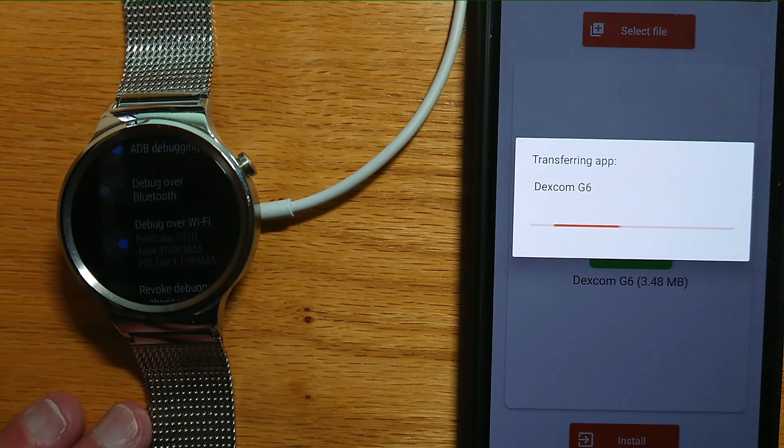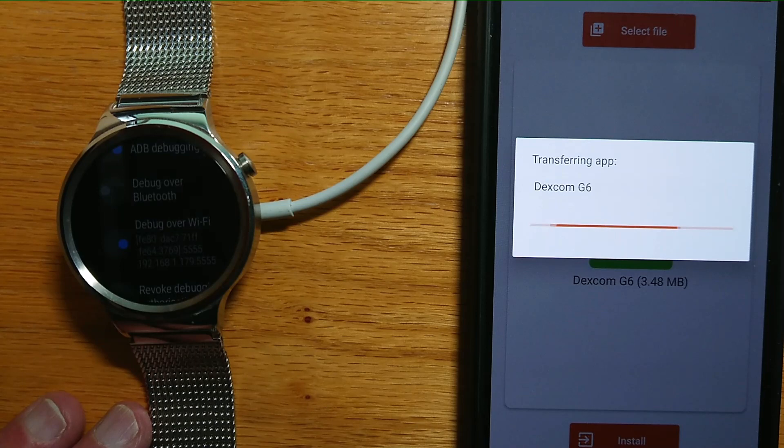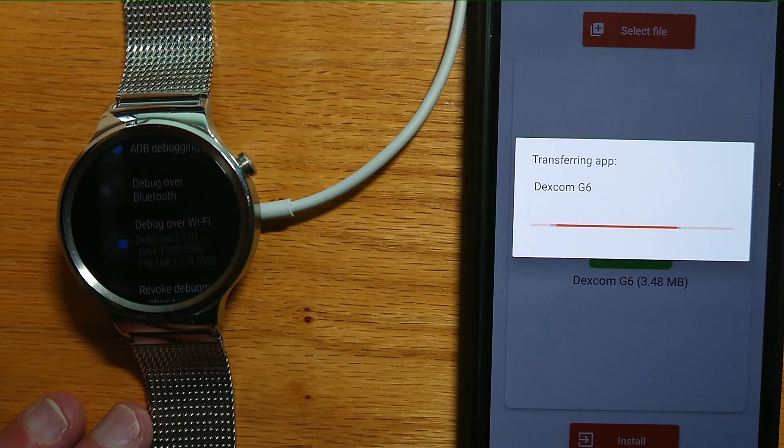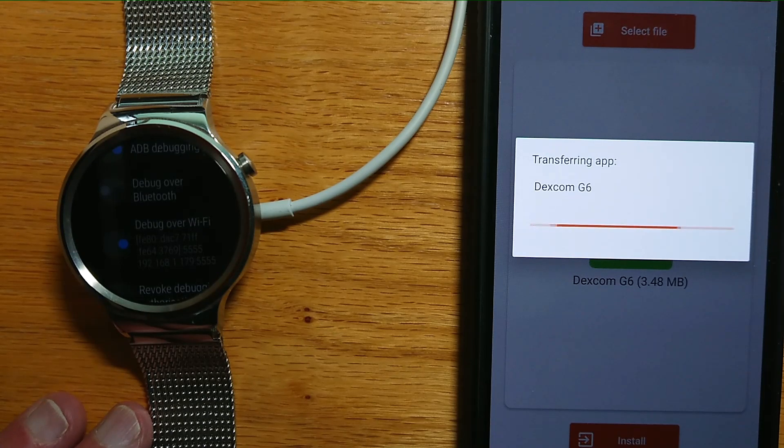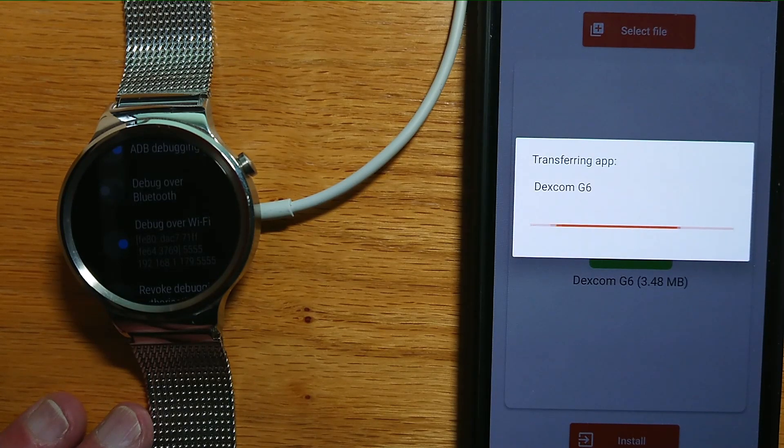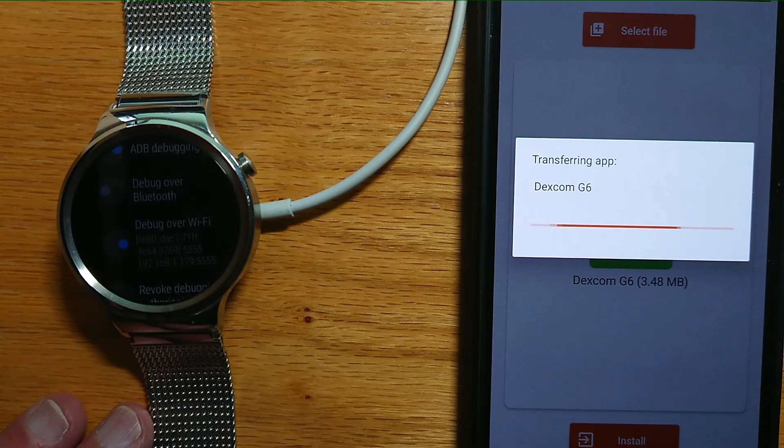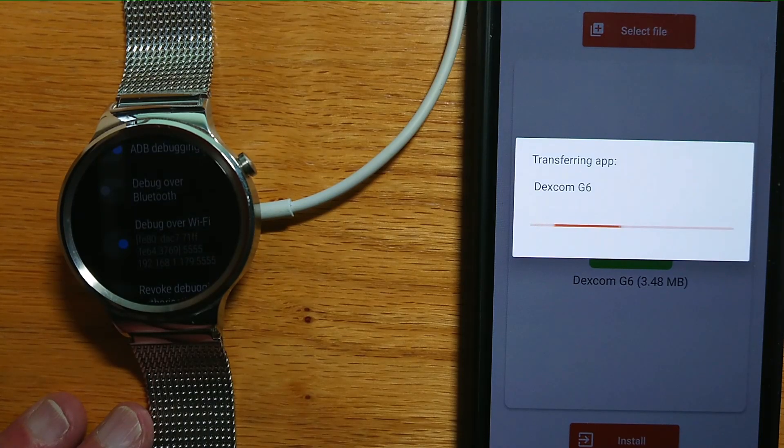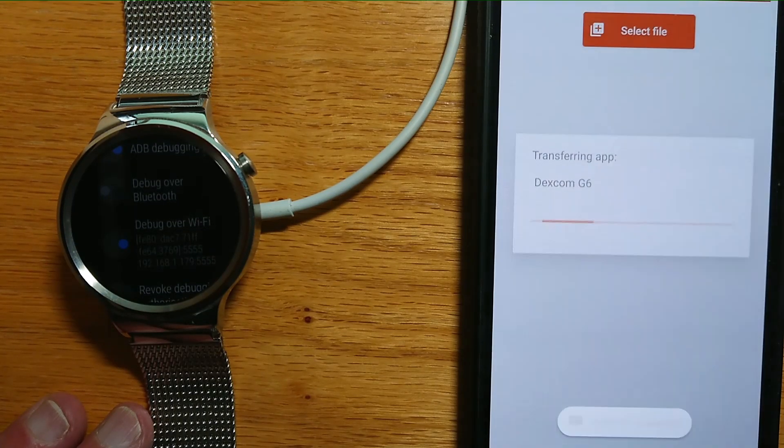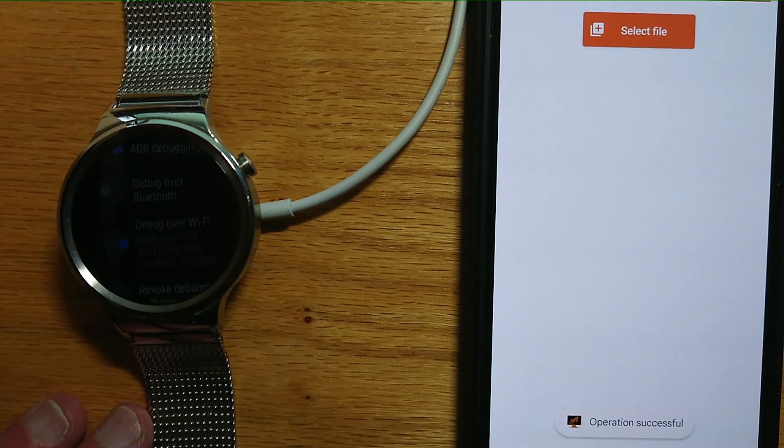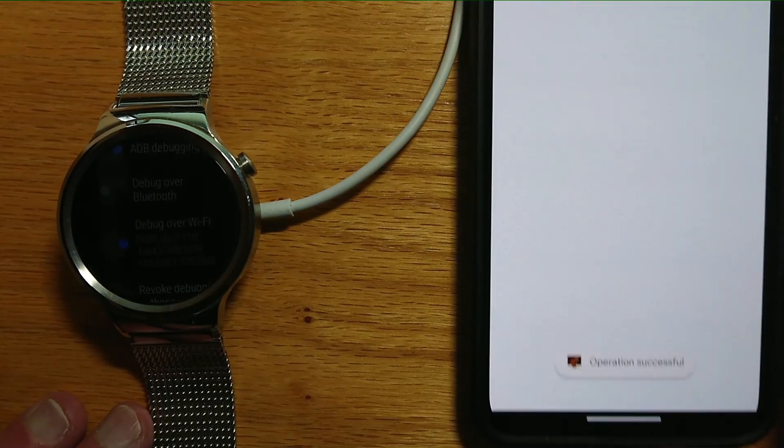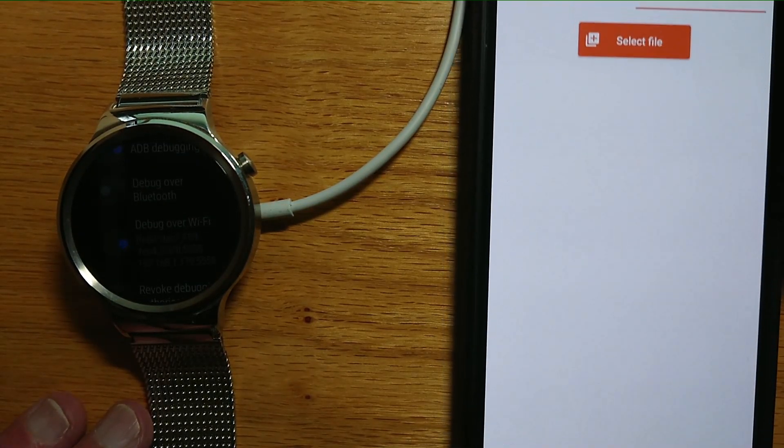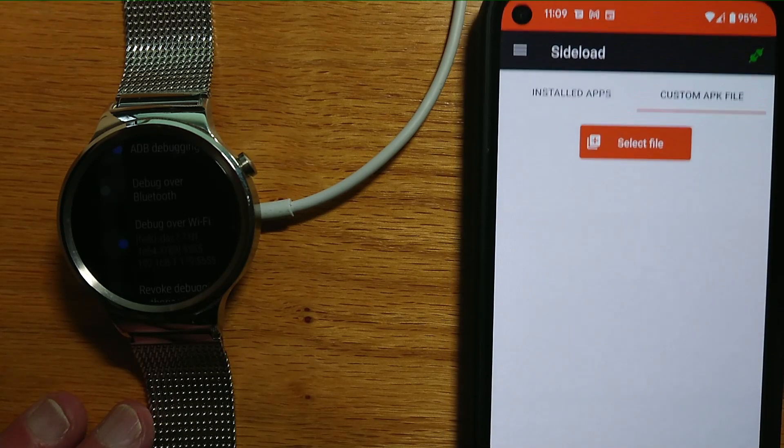It's connected over Wi-Fi on the local area network, and it's taking the Wear APK that we put in the downloads folder and sending it over Wi-Fi from the phone to the watch. I just got a message there to say operation successful.